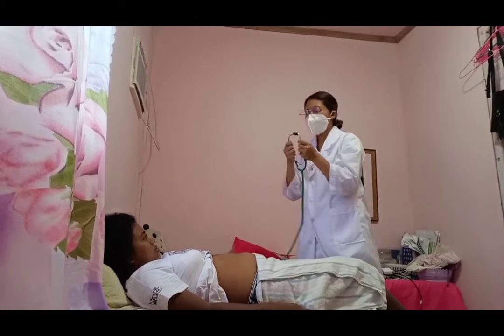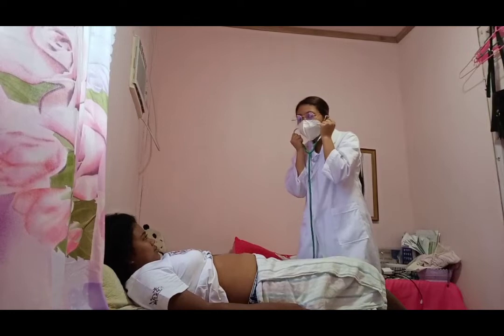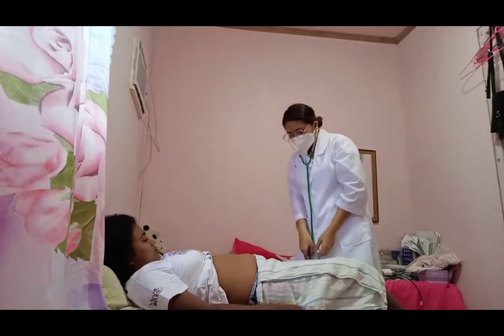Okay, ma'am, I will use this stethoscope to hear the heartbeat.